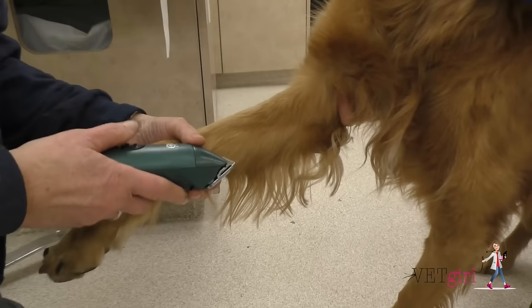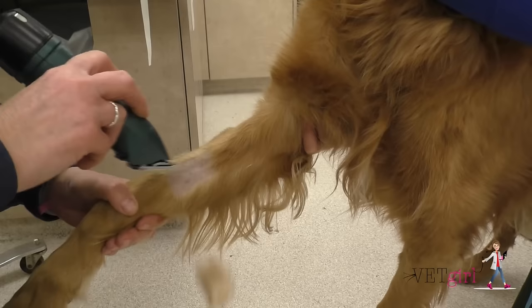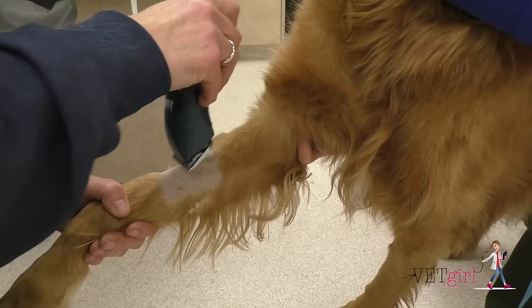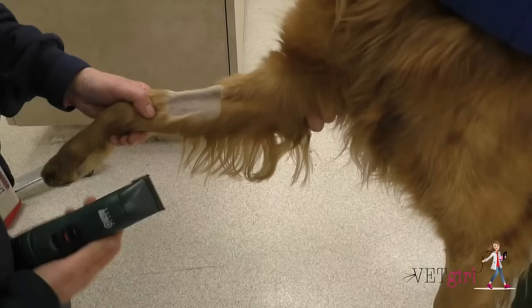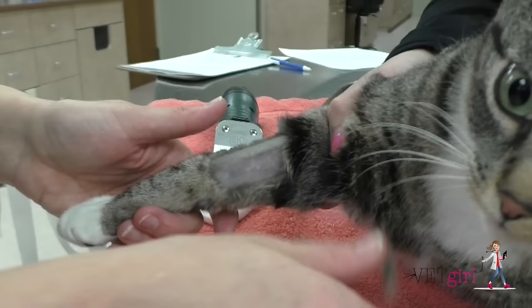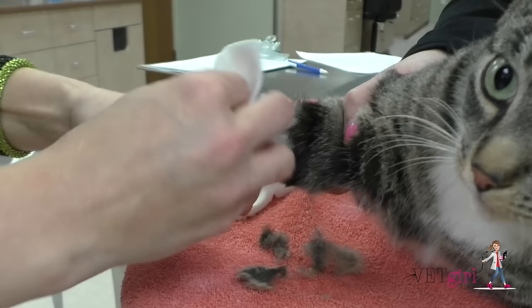The cephalic vein is often the most common and easiest location to use for catheterization. To start, have the restrainer gently hold the patient behind the elbow to secure the limb. Shave a wide margin to maintain a sterile field. Ideally, make sure to have a clean-looking symmetrical shave job, unless it's a life-threatening emergency. Make sure to avoid creating clipper burn or skin irritation.